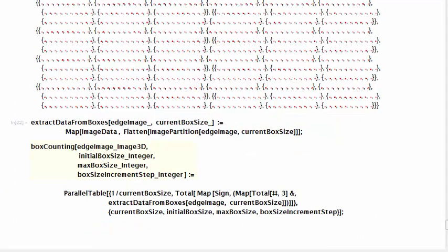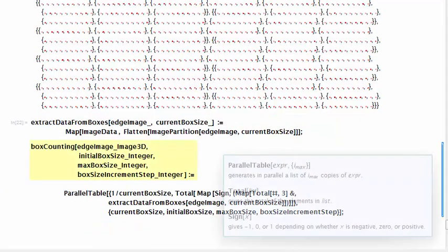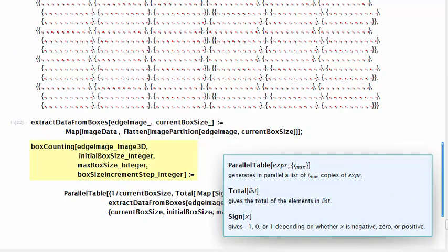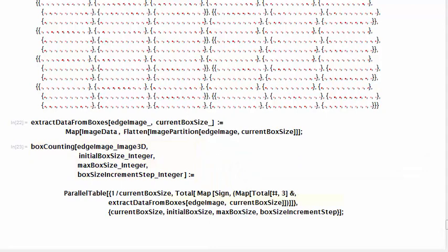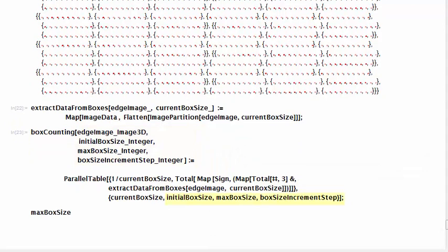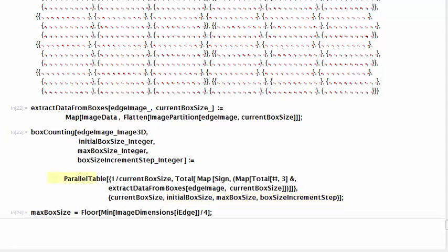We define the function box counting that receives the edge image, an initial size for the box, a maximum size, and the increment between iterations. You can see that these last three parameters are used in the call to parallel table, which is our iterator function. This call to parallel table can be replaced by a call to table and it won't affect the behavior of the algorithm. The call to parallel table is an optimization that exploits the natural parallelization capabilities of functional programming in Mathematica.